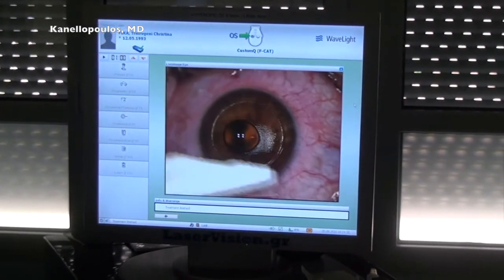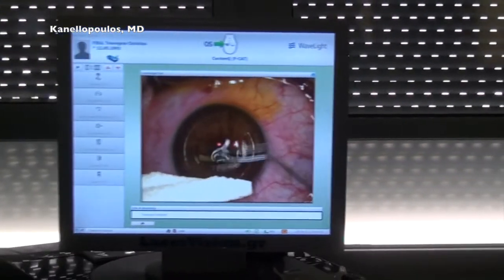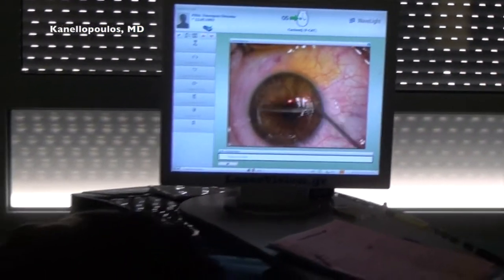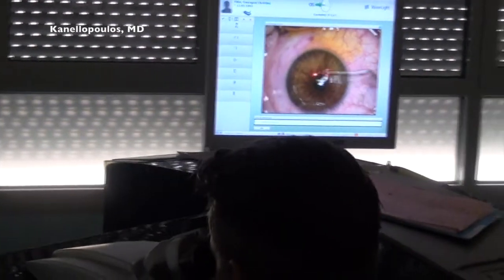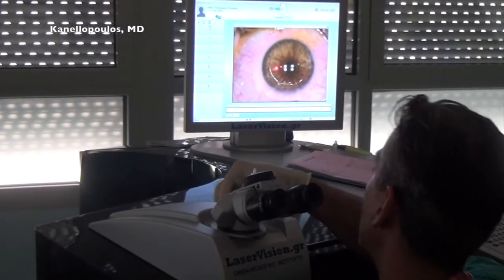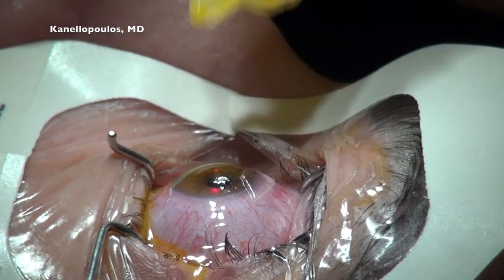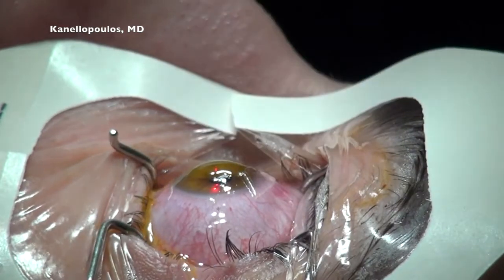we wash the surface and then irrigate under the flap, here's the riboflavin placed carefully onto the exposed stroma and not onto the flap, because once we reposition the flap, we want the UV light to go through the flap that does not contain riboflavin and reach the soaked underlying stroma.